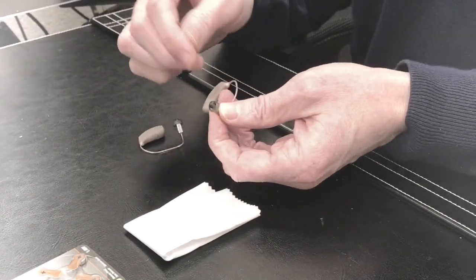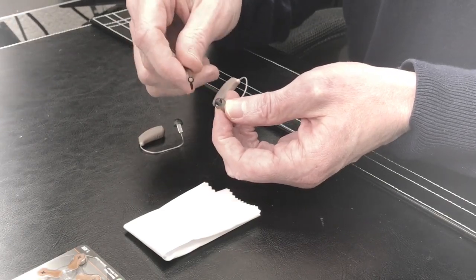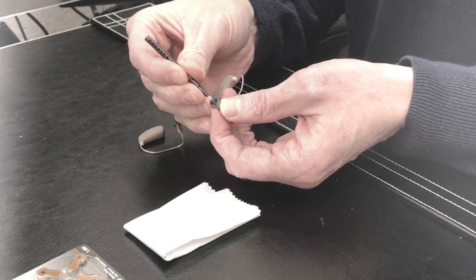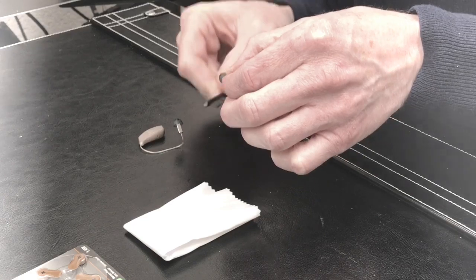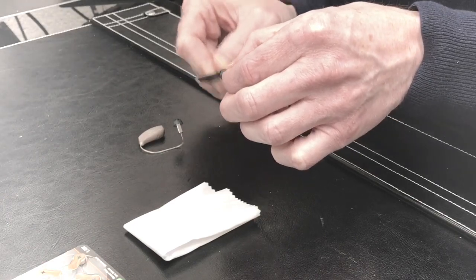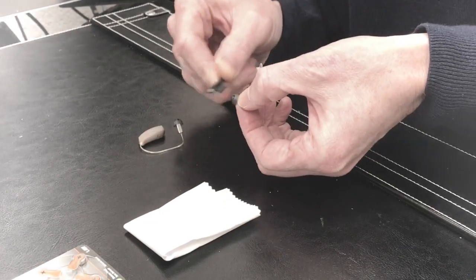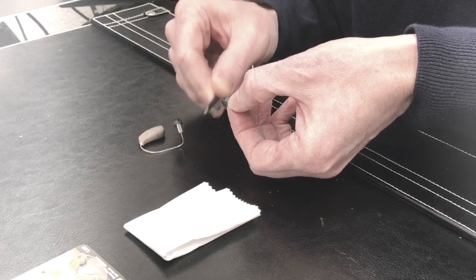On the end of the hearing aid, you've got your dome. And this dome can just be brushed right at the very end. Try to point it towards the ground or surface as you're brushing. And just kind of do that for 15-20 seconds or so.